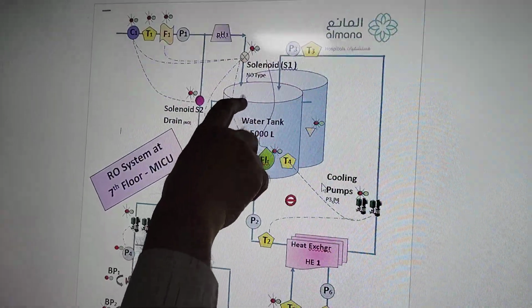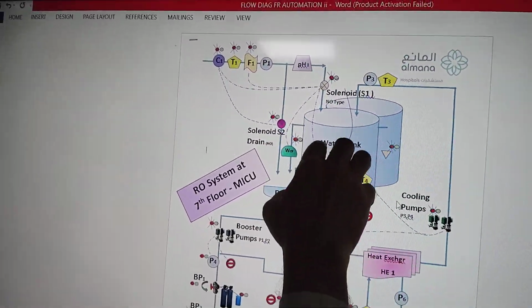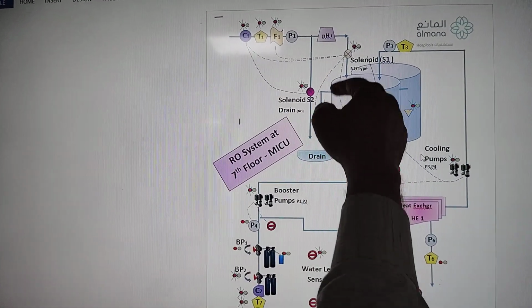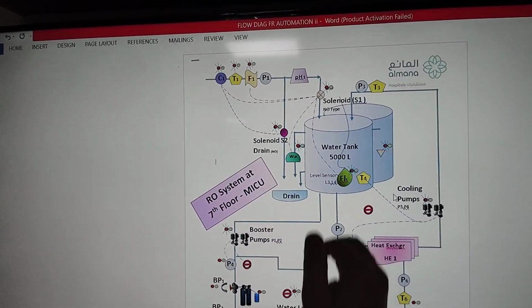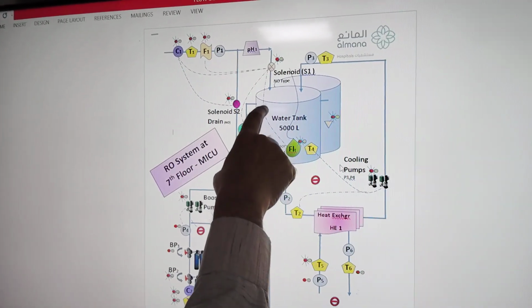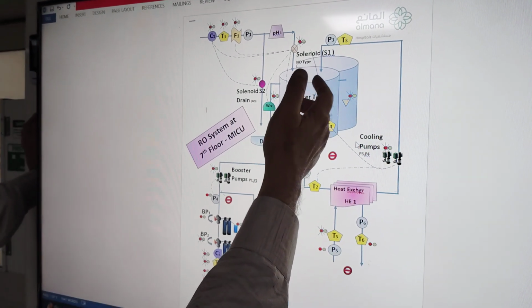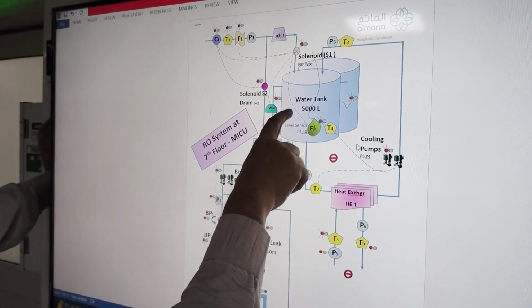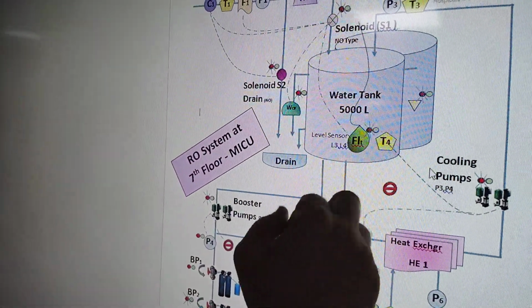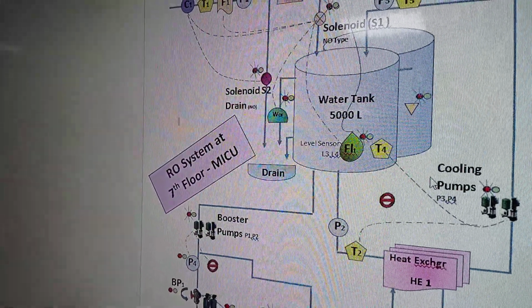When the water is full, it will switch off the solenoid valve and close the water inlet. If the water is at 85%, meaning it has gone down 15%, then it will switch on the solenoid valve again and fill both the tanks. Once it is full, it will give you a blue color indication. When it is half, it will give you a green color indication. When it is 25%, it will give you a red indication plus an alarm, since the water is low. So it will give an alarm.